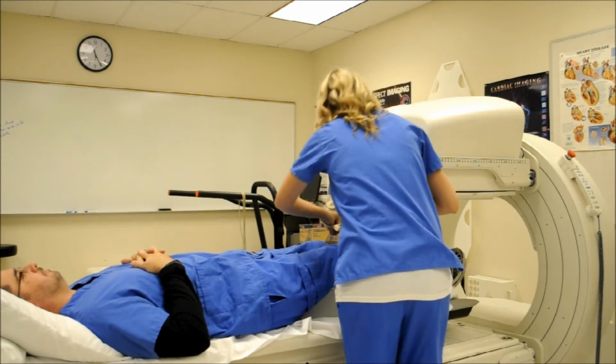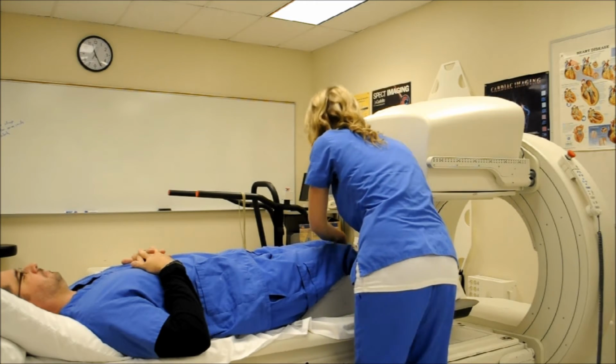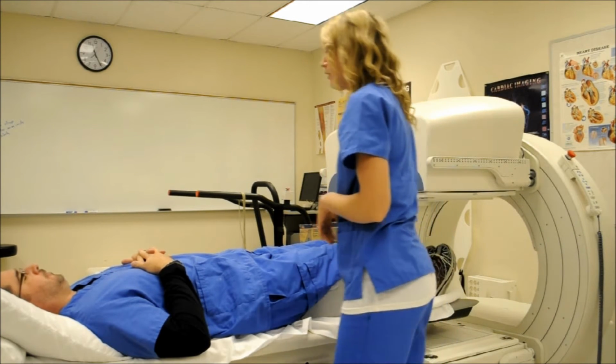And I'm going to tie a little rubber band around your toes to help you keep your legs still, because we don't want you moving during this picture, okay?